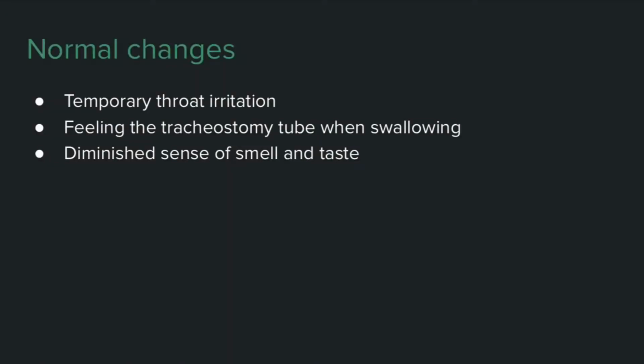It is normal to have some throat irritation initially with the tracheostomy tube. This will improve with time. Some patients will have the sensation of something being stuck in their throat, but this usually improves as well. You will often feel your tracheostomy tube when you swallow. Because less air is going through your nose, patients may have a diminished sense of smell and taste with the tracheostomy tube in place.